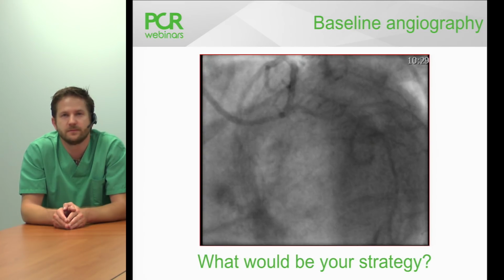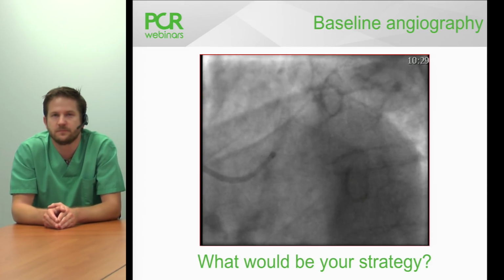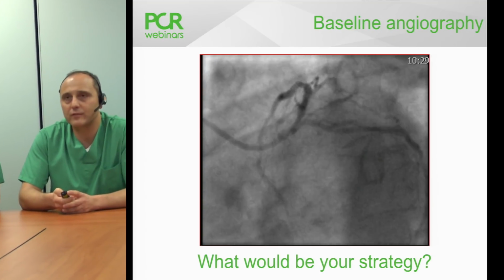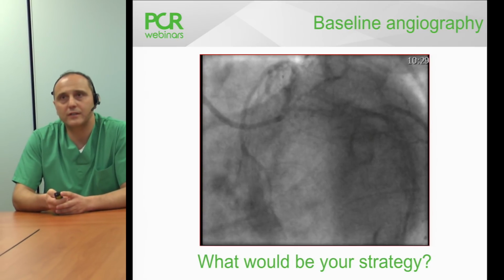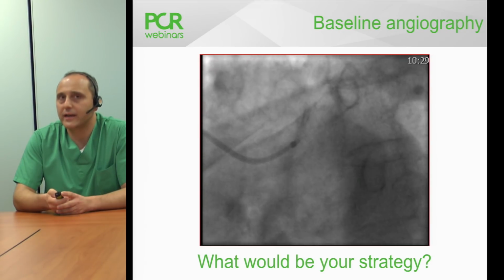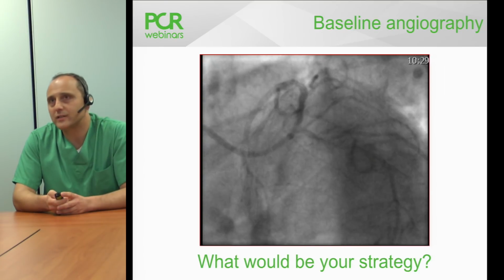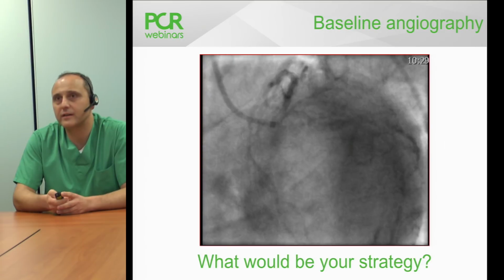And let me just make sure that our colleagues at home are following us. Would you agree with the statement that at this stage we need more information on this case? If yes, please push on agree. So while our colleagues are looking at the angio carefully and making up their mind, we see actually the column really going up. We have a massive feedback here.